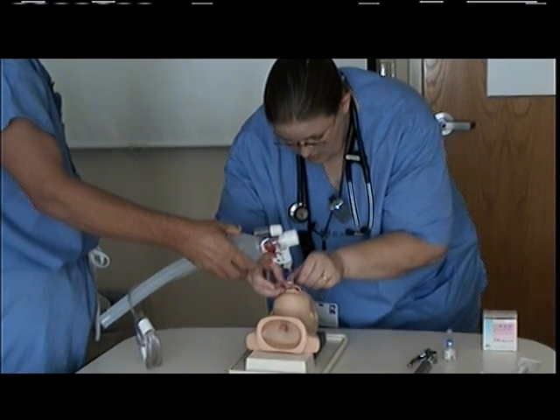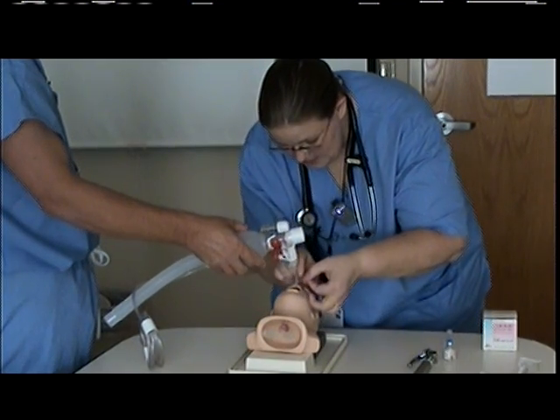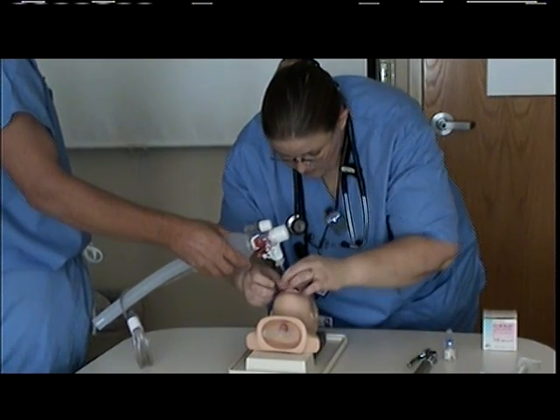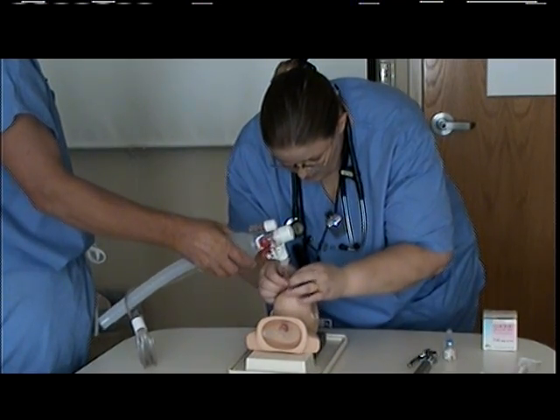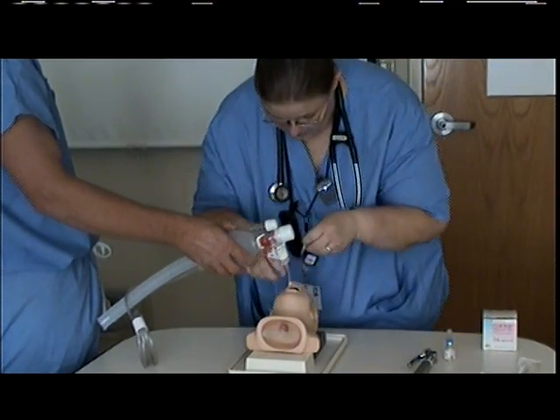Placing the top portion of the tape over the infant's lip, the second portion is going to be wrapped around the ET tube in a spiraling motion. You are going to attach the additional two tapes in the same manner in opposing directions.